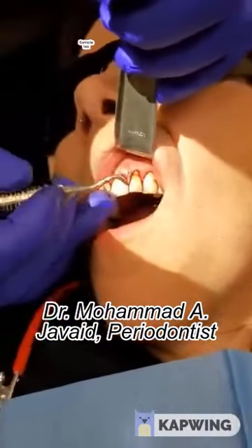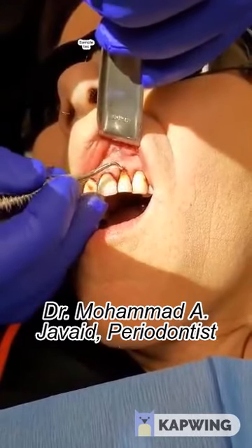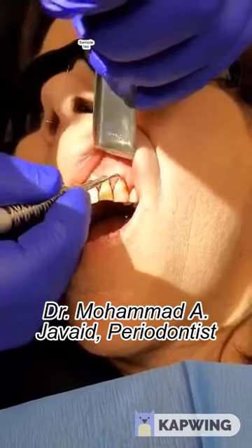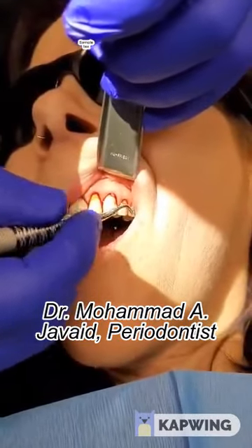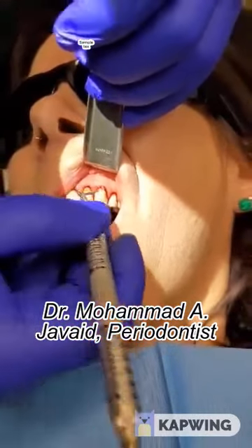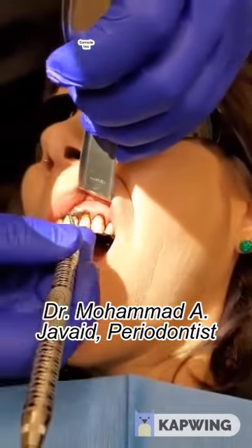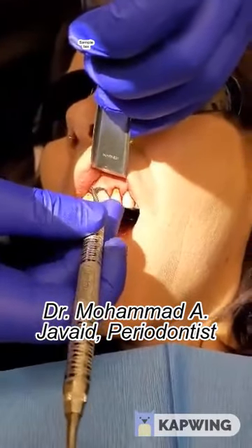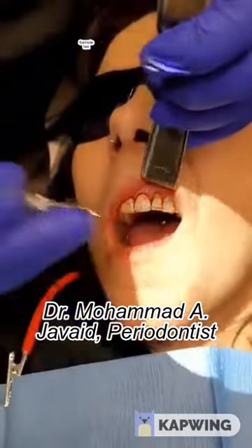You can see the release — we're seeing it again here, looks pretty cool. Almost done, and we go and release the papilla. You can see how thoroughly and nicely the entire tunnel is released, all of them are dissected, and we should be able to pull the tissues. Thanks Tom, that's it.